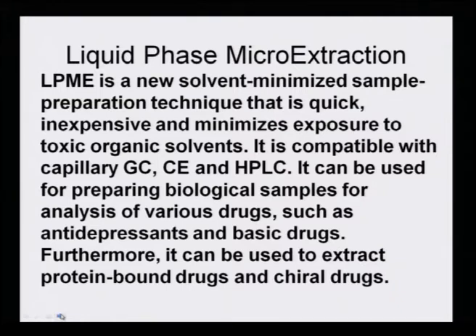It can be used for preparing biological samples, for analysis of various drugs such as antidepressants and basic drugs. Furthermore, it can be used to extract protein-bound drugs and chiral drugs. So, now you can see how specific the extraction is becoming and how newer techniques are being used.